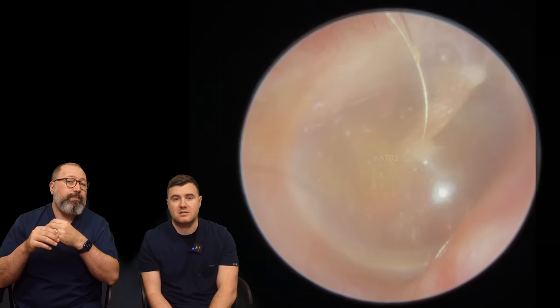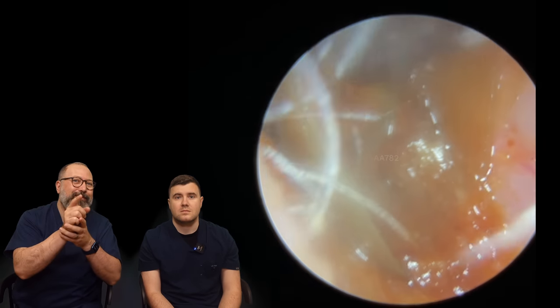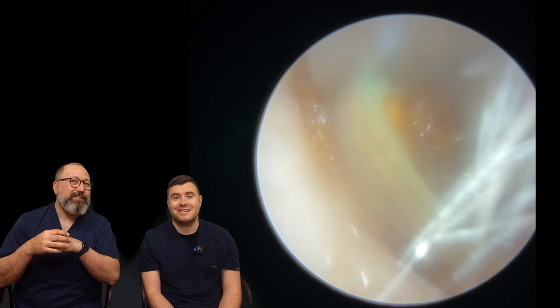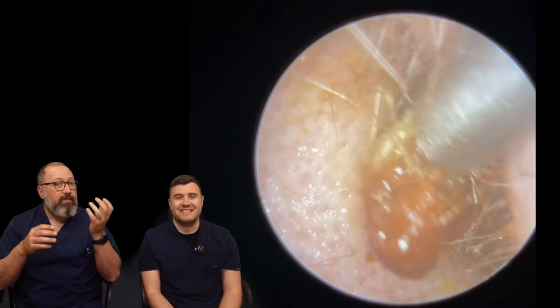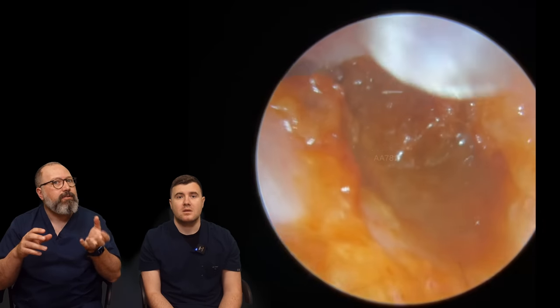It doesn't seem to be coming away too badly — nice and healthy looking. Very similar on this side, though it looks a little bit wetter. What I didn't spot when I first looked in here but I can see now — you can see the edge of a dome. This is a hearing aid dome. I thought that was dead skin. It has a very similar appearance, and it wasn't until I looked closer that I thought, oh right, there's a dome in this patient's ear canal. So that was what was blocking them up. It is very easy to misinterpret it as dead skin. At first glance that's exactly what I thought it was — I went in and was just about to put the tool there, then thought, hang on, that looks a little bit different, there's a little bit too much of a curvature to it.